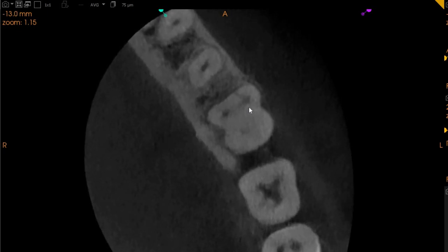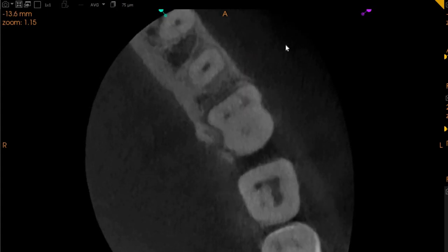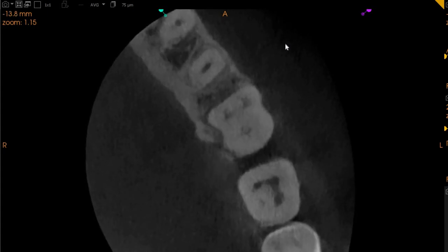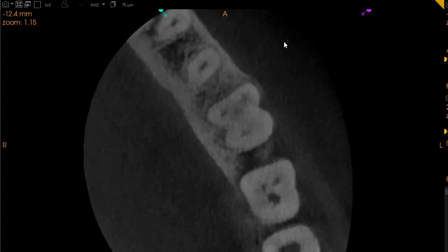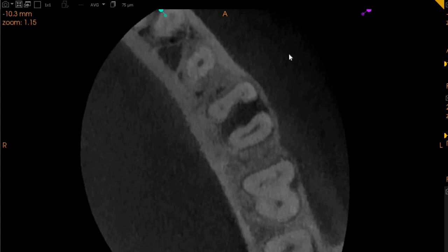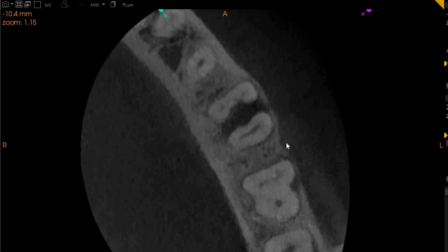When we look at the tooth from a superficial area, again this is where we saw the mesial crack. You can see that the mesial roots are quite significantly cracked. We have a vertical root fracture, which is very evident in all the areas because all these cracks are associated with a radiolucency in the inter-radicular area. Our recommendation would be that this tooth needs to be extracted because there are vertical root fractures at multiple segments.